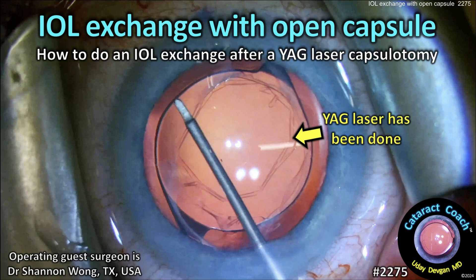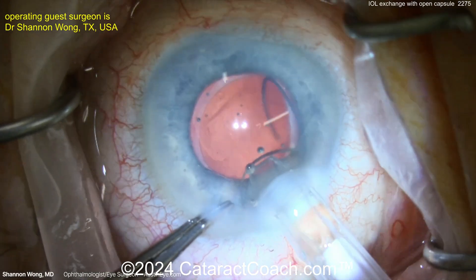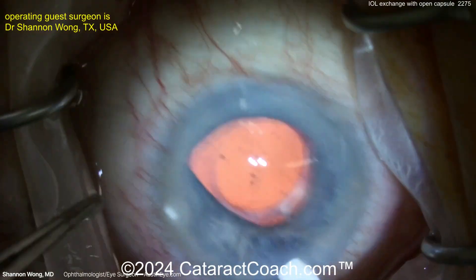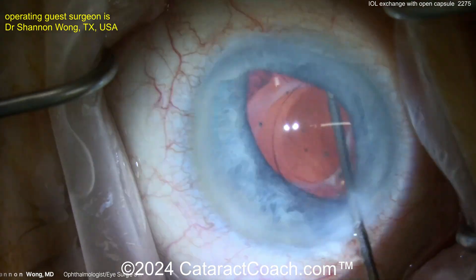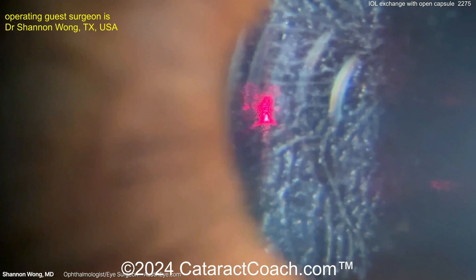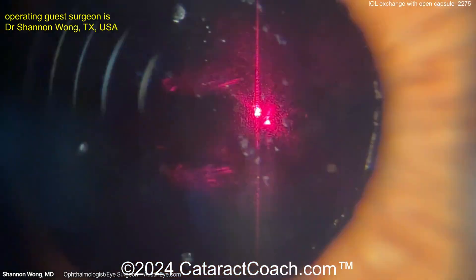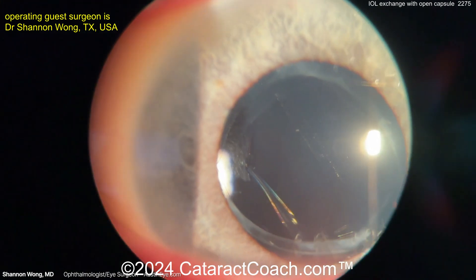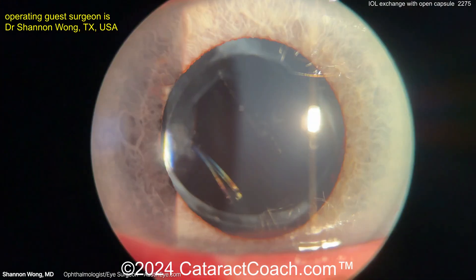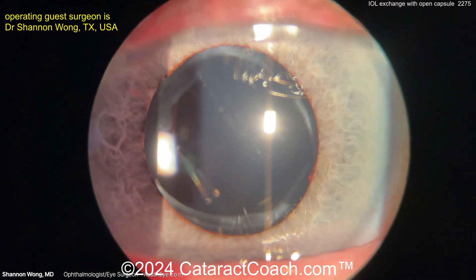cataractcoach.com: IOL exchange with an open capsule — how to do an IOL exchange after a YAG laser capsulotomy. We've been taught to put a three-piece lens in after an IOL exchange, especially if the capsule is open. You can put that lens in the sulcus, maybe optic-captured, but no single-piece acrylic lenses. A patient with a multifocal lens in the capsular bag and a lot of PCO undergoes a YAG laser capsulotomy. The patient's still not happy, and now the posterior capsule is wide open. You both decide to exchange that IOL.